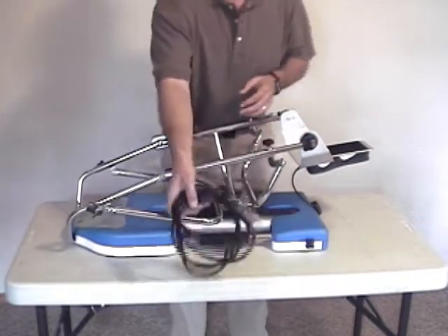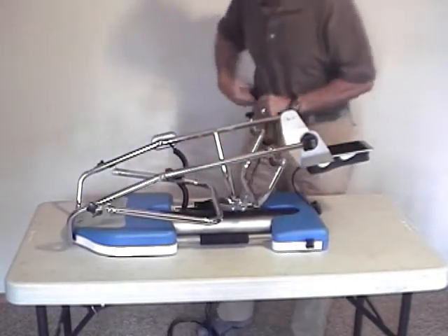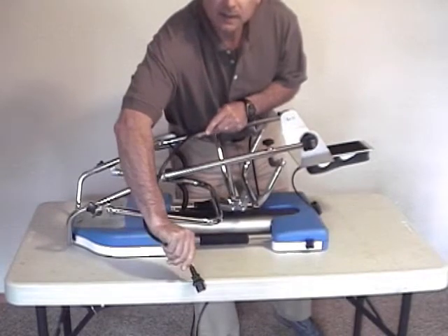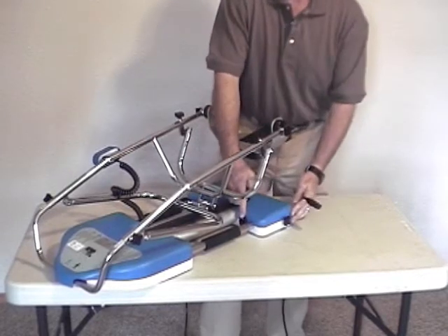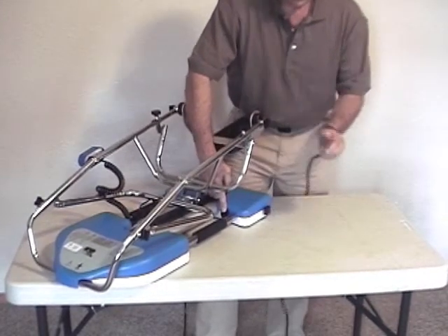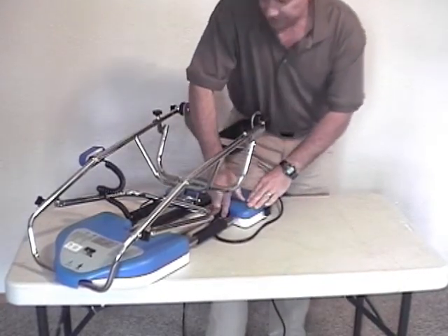Start first of all with the power cord. One end will plug into a wall receptacle. The other end of the power cord will plug into a receptacle just inside the handle on the right side of the CPM machine where my finger is pointing. When you get it correctly seated, make sure that it's seated properly.